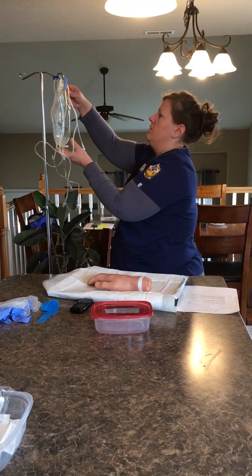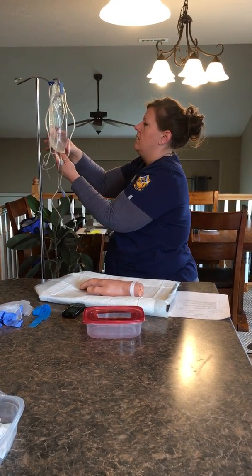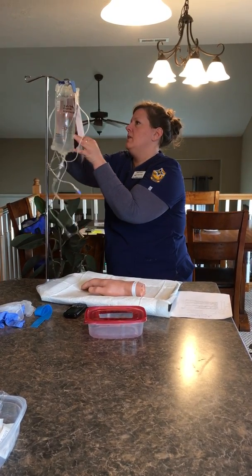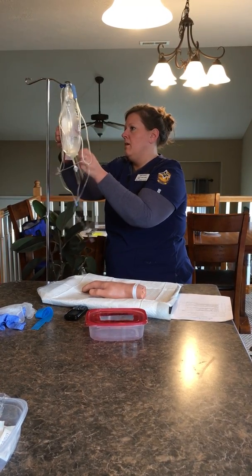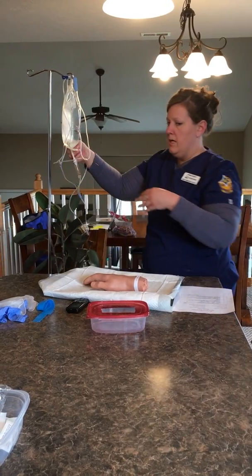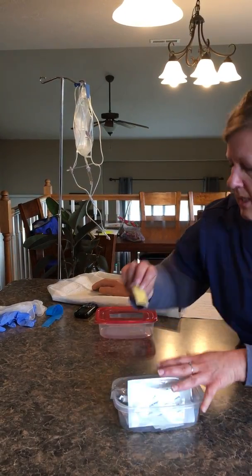There's an arrow for the 0, so where it starts. I'm going to do it on the back side, just there we go. And then I'm also going to label my tubing.